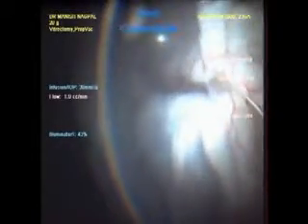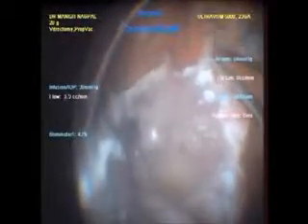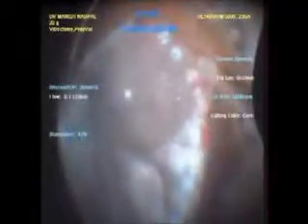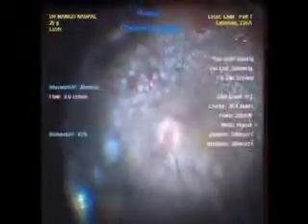Even after removal of membranes, there is significant retinal contraction. Retinectomy is undertaken and is gradually extended to 360 degrees. After this, a 360-degree laser barrage is carried out.